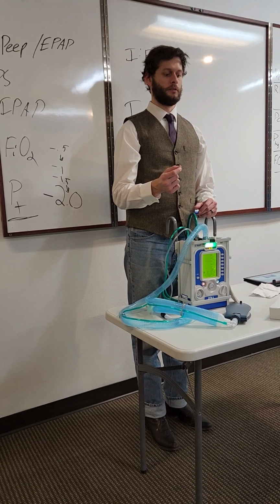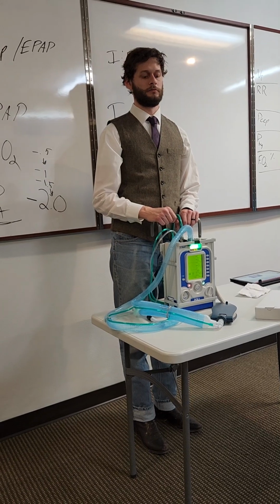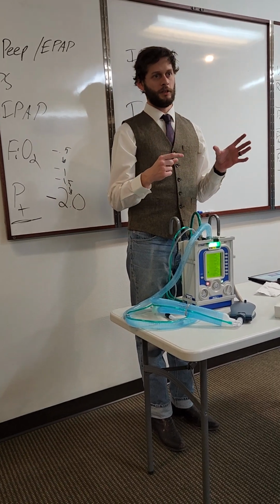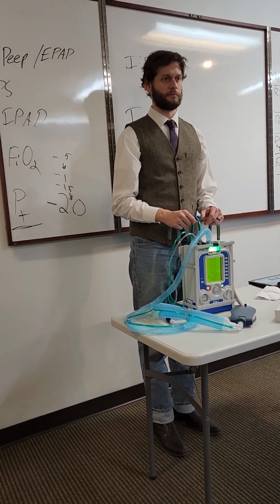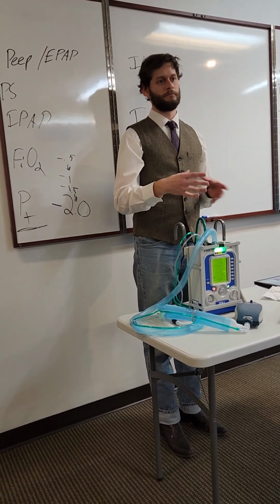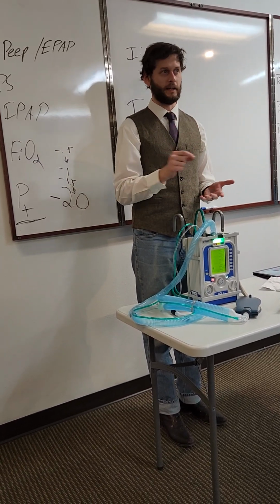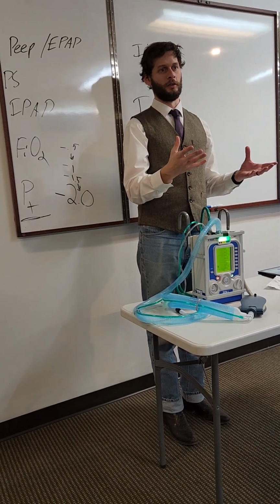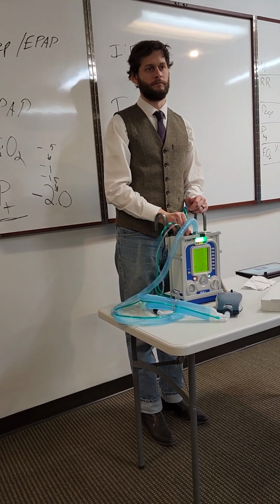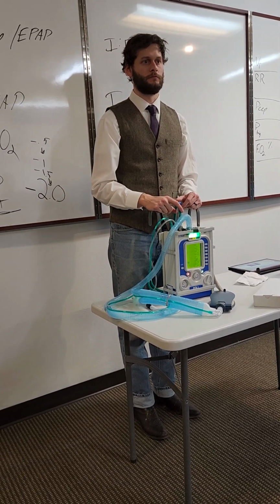The other thing is that when we're running these ventilators, we're not going to have the test lung with us at all times. So when you're setting up that vent and putting in those settings, it's probably going to be alarming and kind of annoying. Obviously you can cancel it, get your settings in, and then turn it off. But you can't sit there and do it one by one. So you're going to want to either write down your settings or put them in all at once instead of running in and out of the room. That's what I've seen in practice: they'd ask what are my numbers, and enter them one at a time on the whole vent, but you can just write them down and hit it all at once.